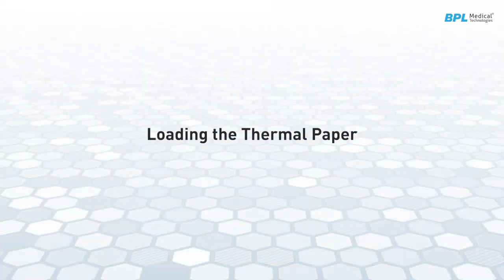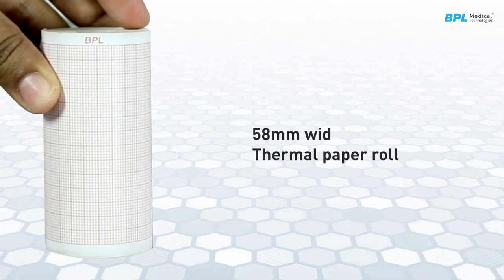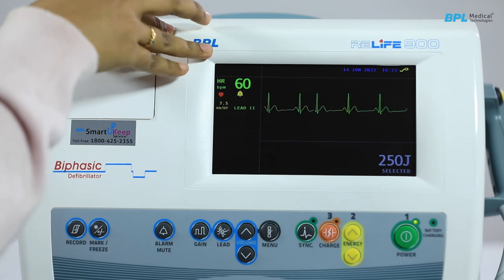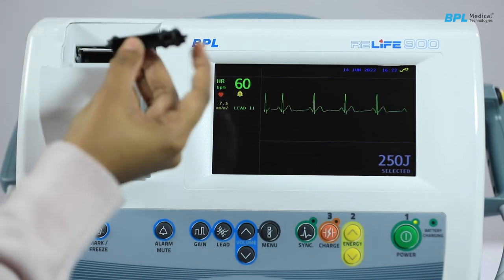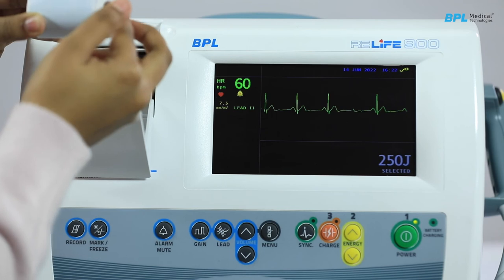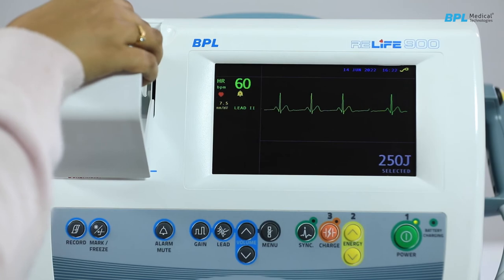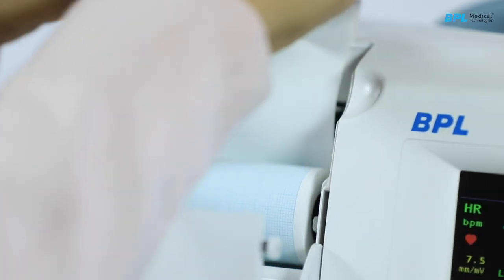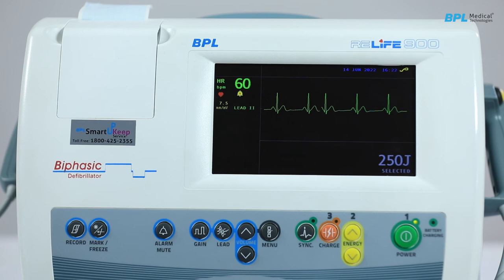Loading the thermal paper. This defibrillator uses a 58 mm wide thermal paper roll. To load the paper roll, pull the printer door forward to expose the rubber roller as shown. Insert the paper spindle into the roller and place it on the groove provided inside the printer compartment. Ensure that the grid surface of the paper is facing the thermal printer head. Pull the free end of the paper until the paper comes out of the printer compartment. Close the printer door after aligning the paper grids parallel to the edge of the printer compartment.